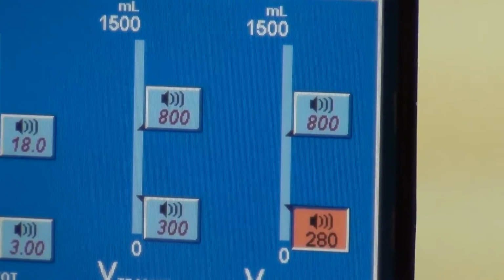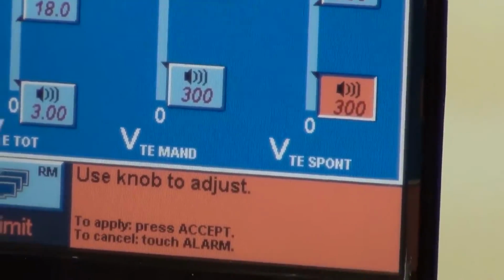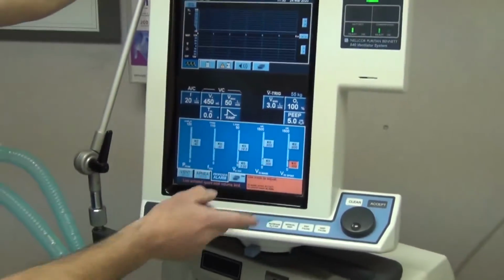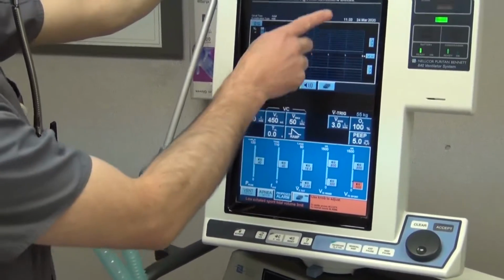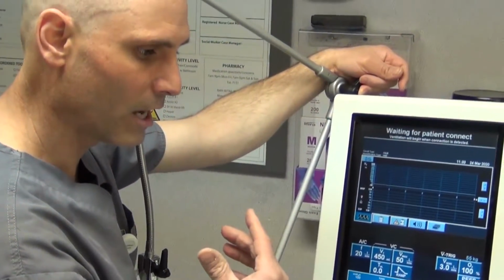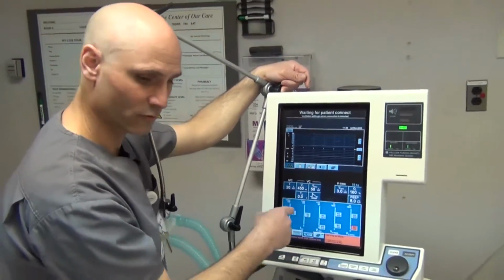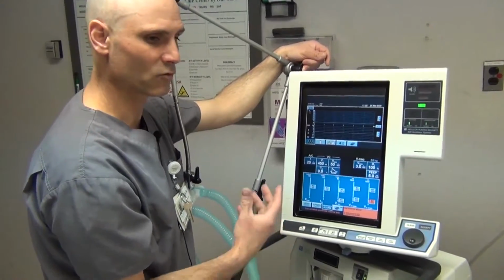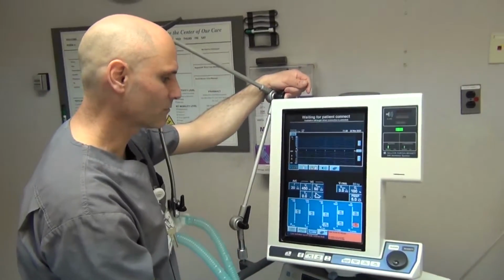And then we're going to do the same thing with the one next to it, which is a spontaneous alarm. If we put the ventilator into a spontaneous mode when we do weaning, we keep those the same. So at this point, if the patient breathes more than 800 milliliters per breath, then it'll alarm. And if he breathes less than 300, the vent will alarm. That way, if there's something wrong, their breaths are getting too shallow, we get some type of warning.